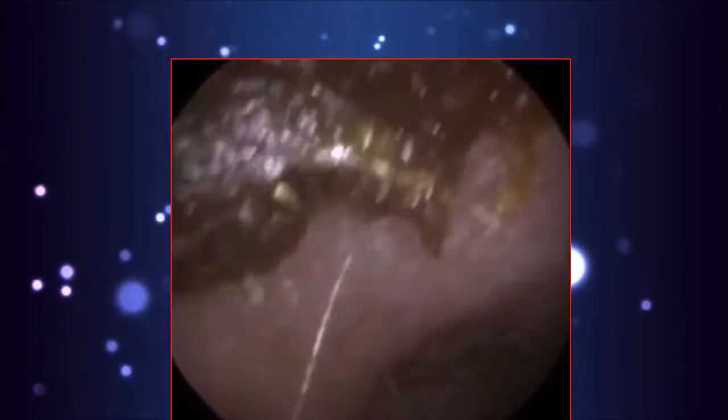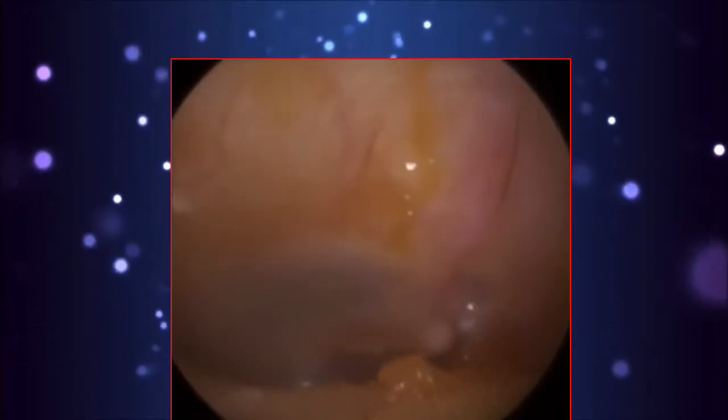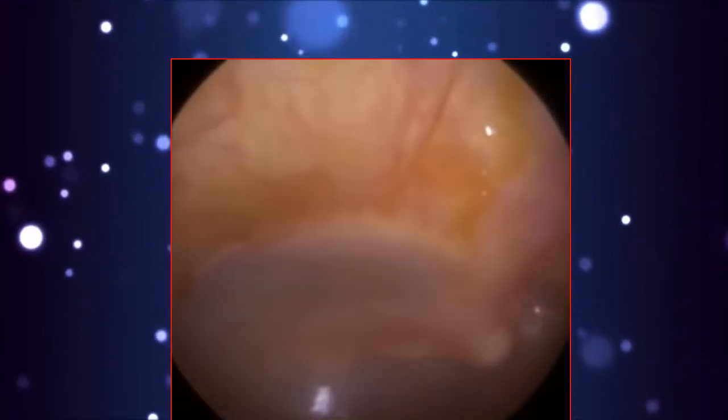This is where the second bend is here to the left-hand side. You can see the canal wall. So I've managed to extract this wax forwards, bring it laterally out of the entrance. You can see the angle I'm going there, so I'm having to go up and to the right to visualise the eardrum. Patient has got a small attic retraction, so the top part of the eardrum, you can see there's a little pocket there, and that's due to eustachian tube dysfunction.